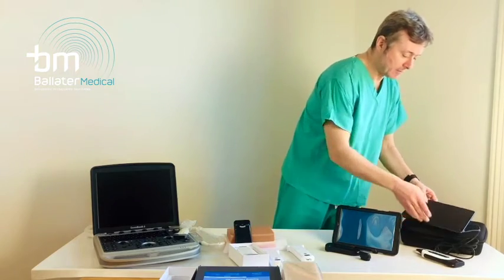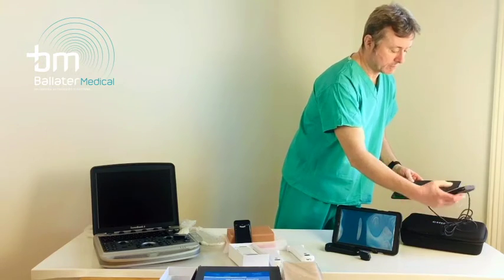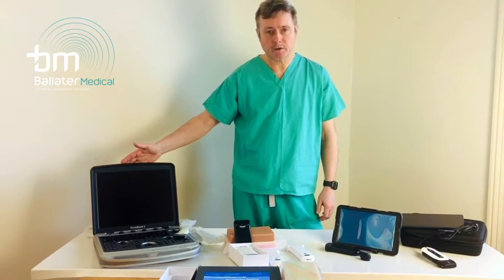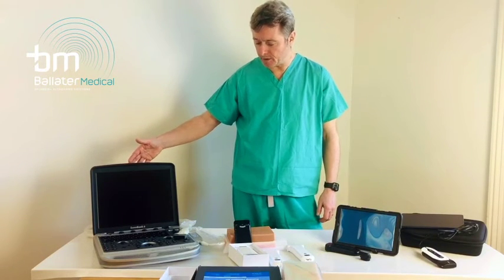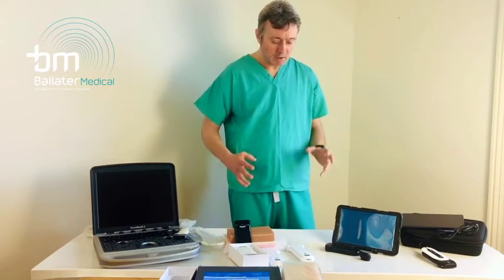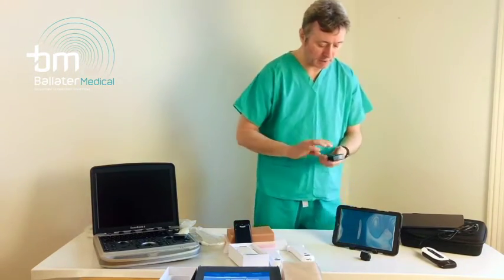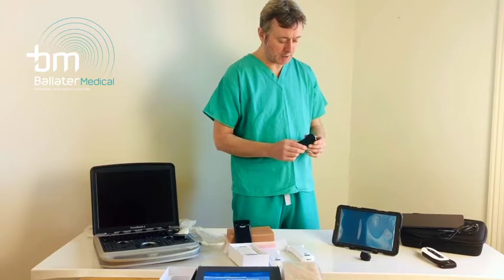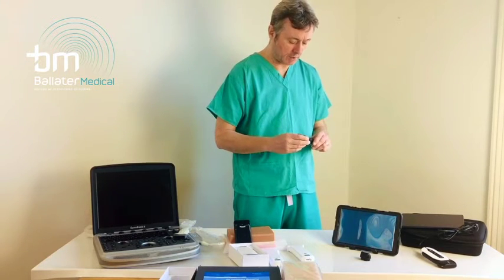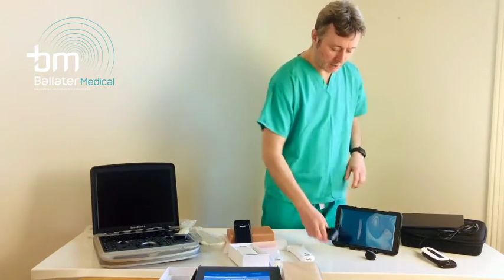Here's an example of a cable connection to a tablet or smartphone. This one from the company Kaison. Of course, laptop devices are becoming compact now, offering the same sort of ability to teach our students, albeit in a slightly different setting. Wireless technology lends itself particularly well to this, and here's an example of a nice product now available through the company, this one from Yuki. It offers a nice feature of detachable transducer head, which allows you to cover quite a frequency range and different applications.